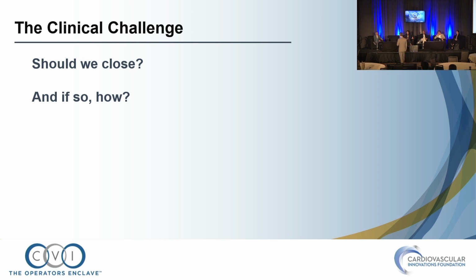How long after surgery were these images obtained? The patient came to see me. The CT scan was done about 3 months after the ligation, the atrial clip. The patient was still anticoagulated, tolerating reasonably well, but had a history of GI bleeding, has a HAS-BLED score of 3, and was very motivated to get off of anticoagulation. So thinking towards closure. I'm not sure what they clipped. Maybe just the tip of the left atrial appendage.